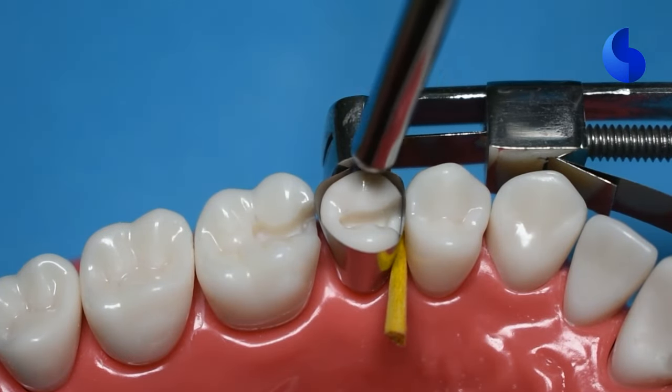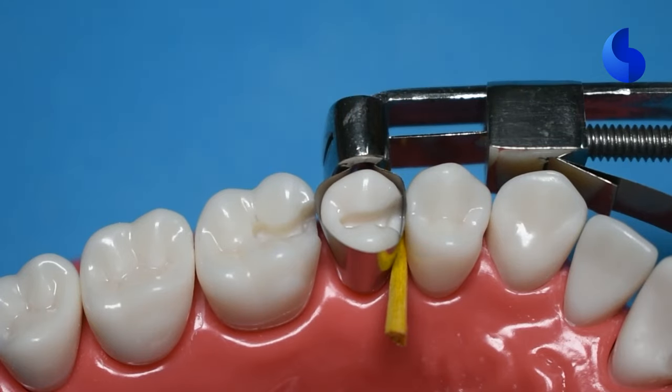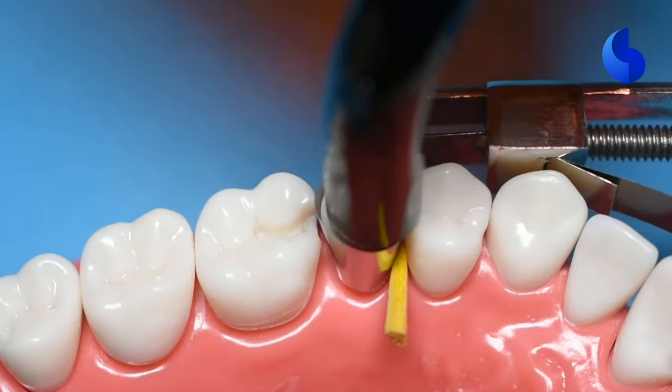And also make sure you burnish your matrix band to the adjacent tooth so that when you place your restorative material, you get that ideal contact you're looking for.